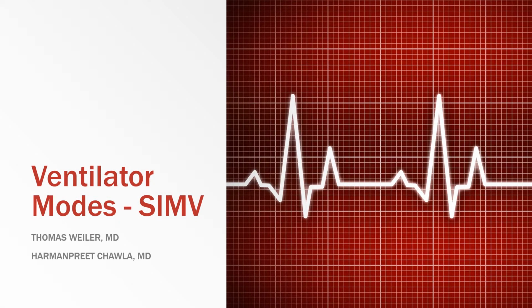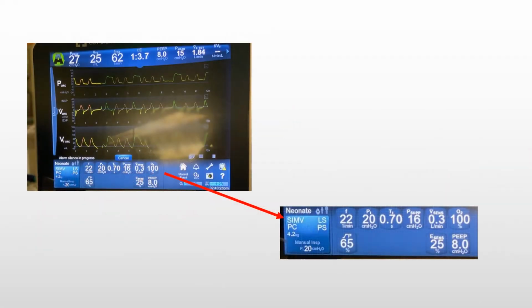I am a pediatric intensivist at Presbyterian Hospital, and today we are going to continue our lecture series and really discuss ventilator modes, and more specifically SIMV. For the purposes of this lecture, we will be using the interface from the Puritan Bennett 980 series of ventilators, this just being the ventilators that we have available in our hospital.